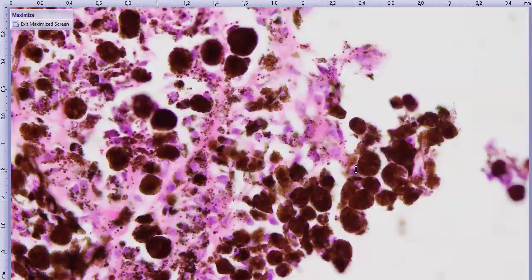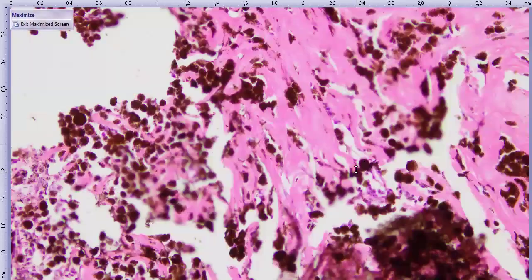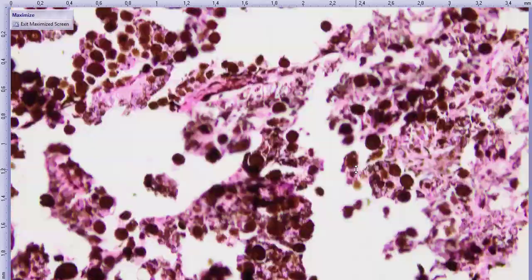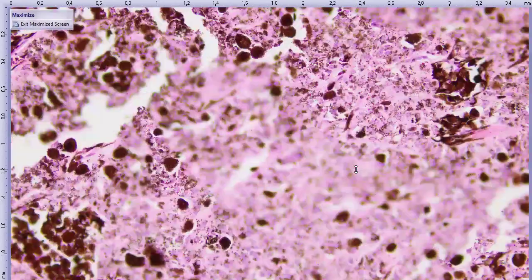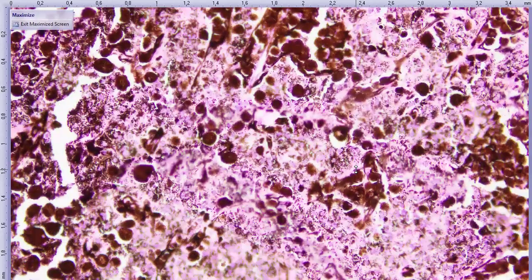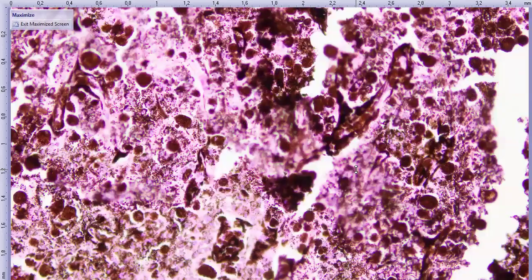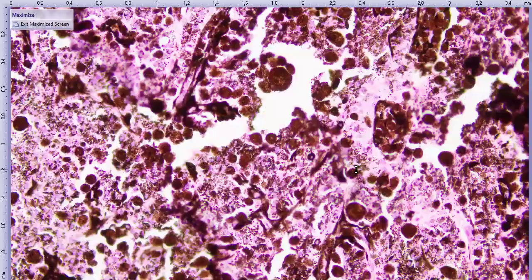So we were suspecting that this part of the tumor is also epithelial. And then you ask me, wait a minute, a pigmented epithelial tumor? Well, yep, especially in the eye, we know that there are a few epithelial layers in the eye that are pigmented, like the iris and ciliary body pigmented epithelium and the RPE cells.